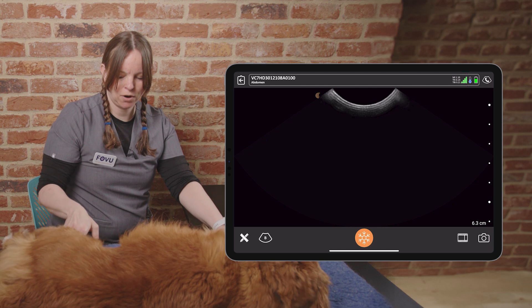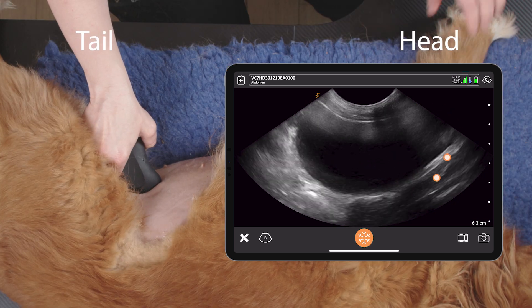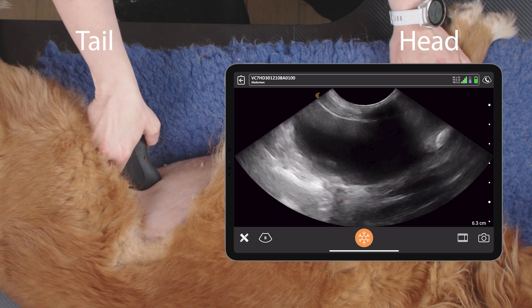We look for the cystocolic view, where we find our bladder and our colon, and again, we fan and we rock.